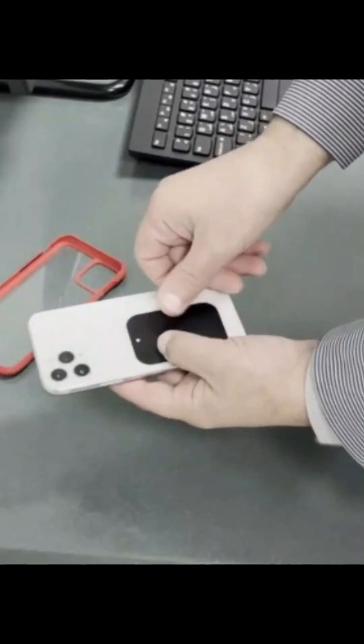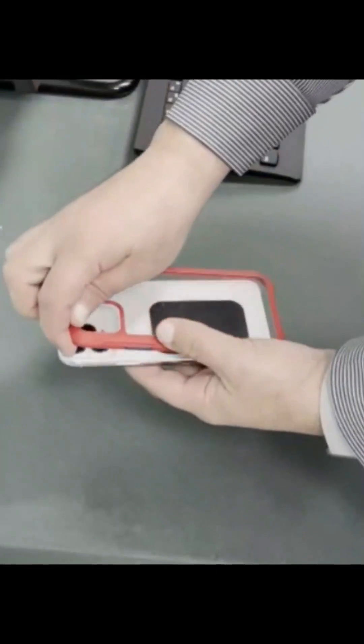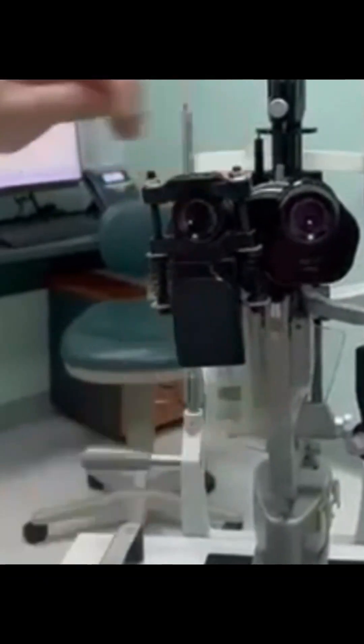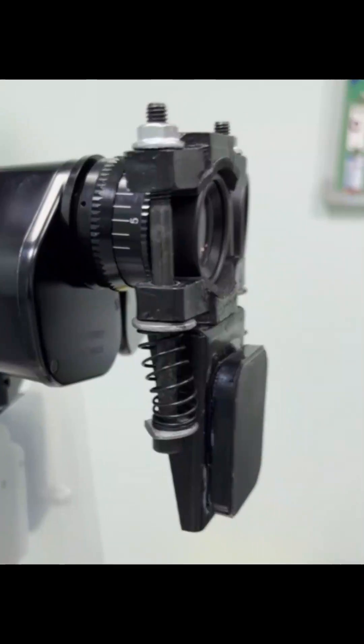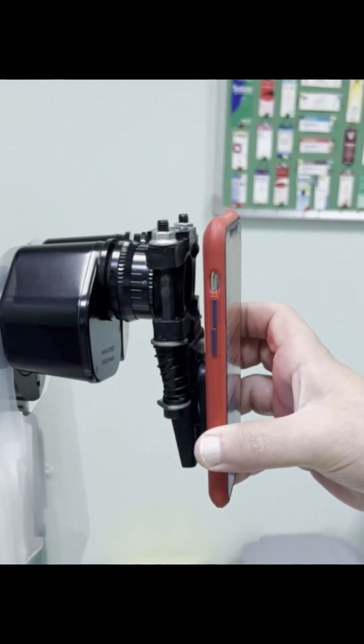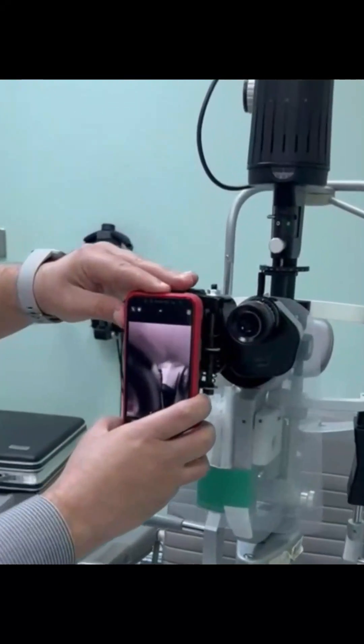Insert the attached metal plate between your smartphone and its cover. Spread the space for the ocular of the slit lamp apart and apply it to the ocular of the slit lamp — it will be self-retained there thanks to the spring action. Then attach the smartphone to the magnet of the adapter.